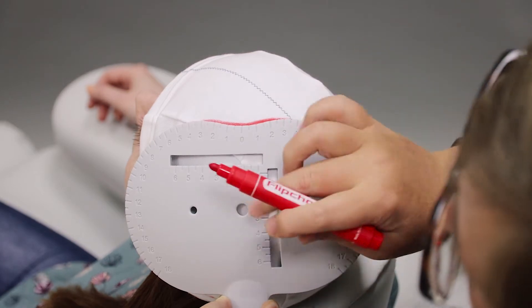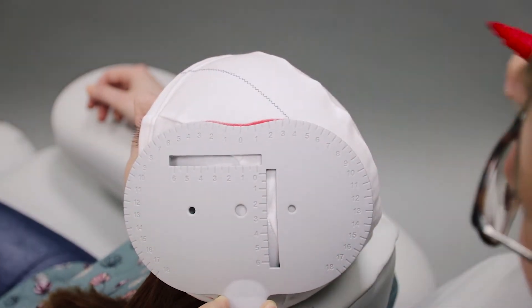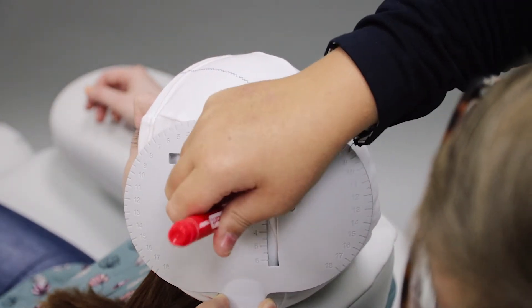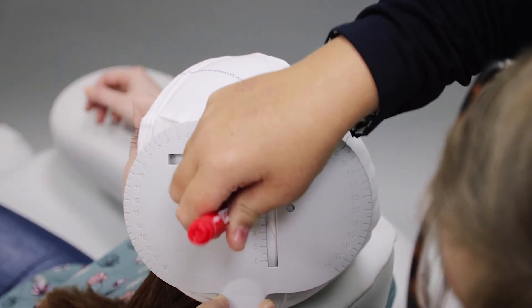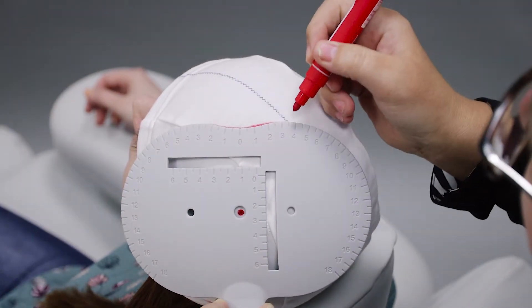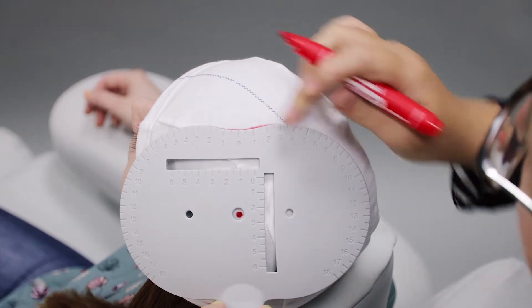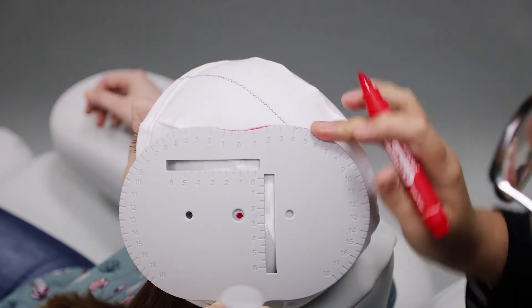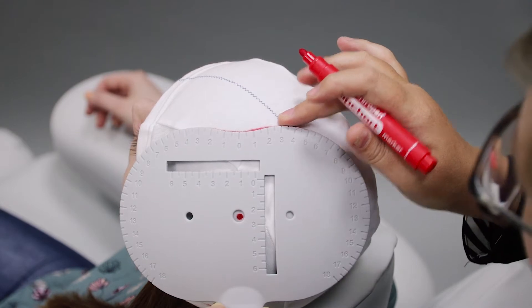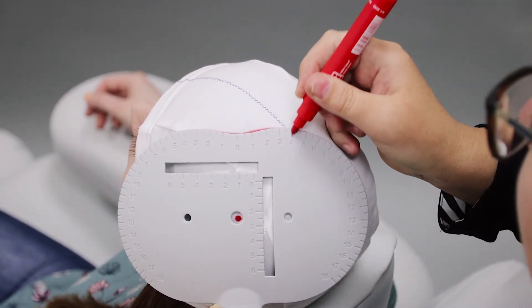There is a hole in the center of the coil positioning tool, and I draw a point on the cap through this hole. I remember the number at which the coil positioning tool crosses the center line of the cap — in our case it is 4.